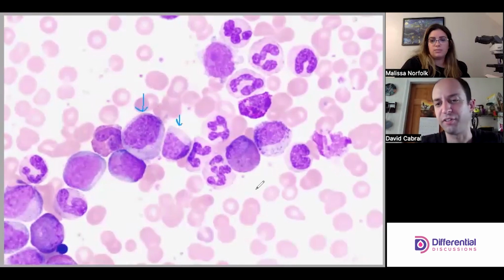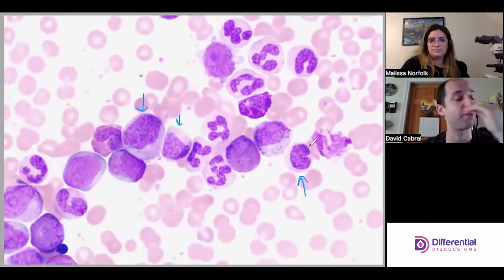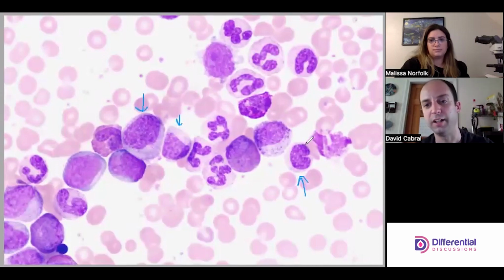I actually got excited for another cell that's coming up. One to the right, one more. I'm actually a little excited to do some measuring and some splitting of hairs on this one, because I think you would probably have a lot of people argue about band or not. In all reality, I don't really care personally, but I think it's worth talking about a little bit.